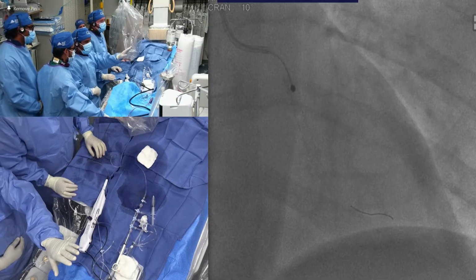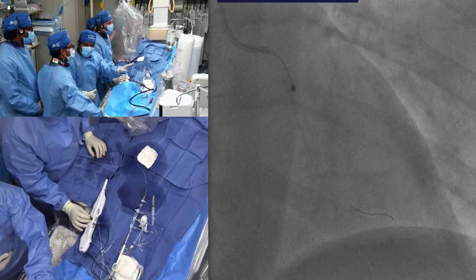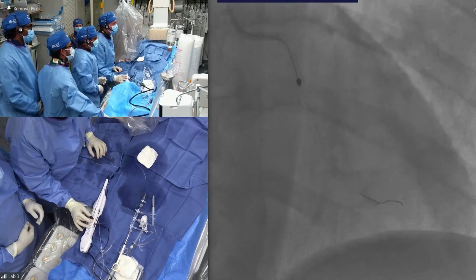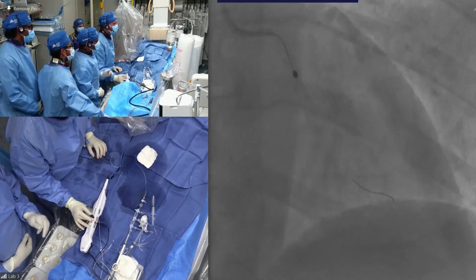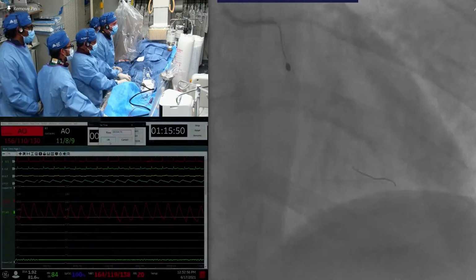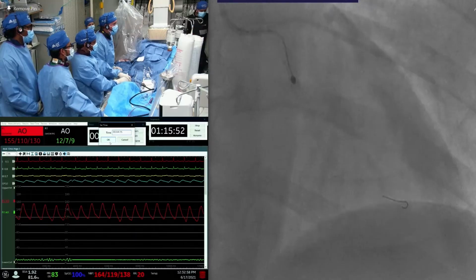We'll see a few seconds, two more runs. We'll downsize to 1.75. I think aminophylline is excellent. We stop using pacemaker. Oh, you're using aminophylline infusion. All right, excellent. We stop having perforations of the right ventricle.